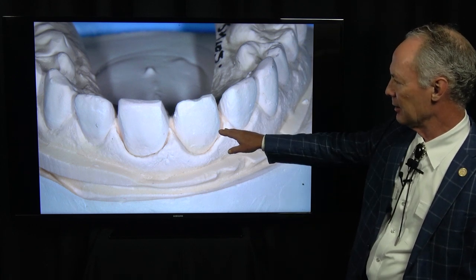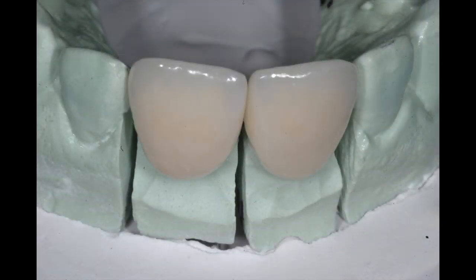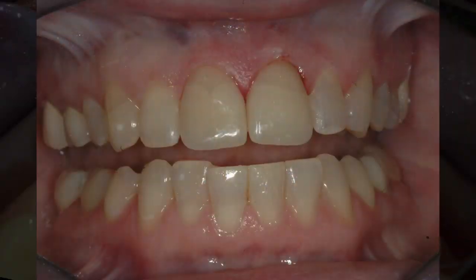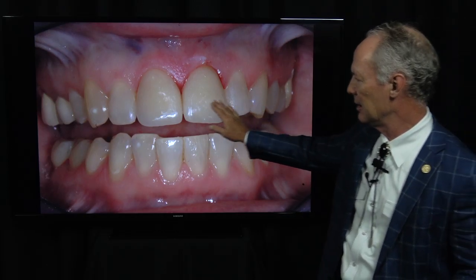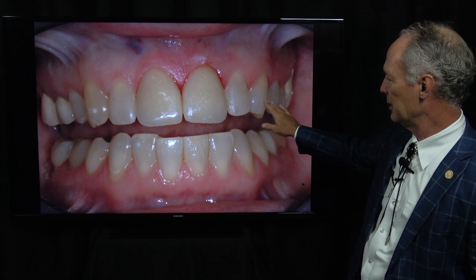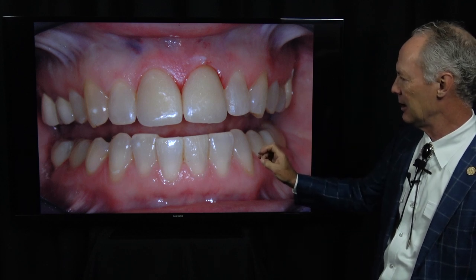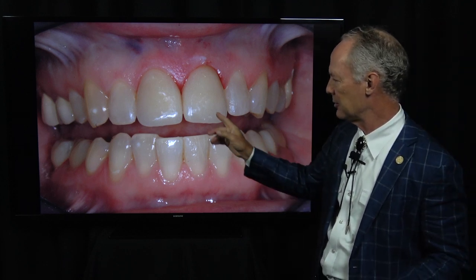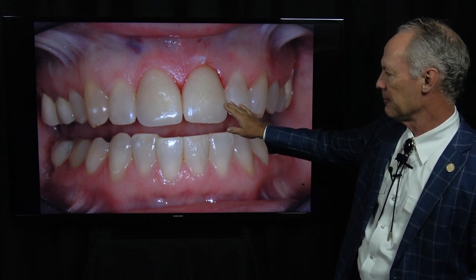This is a solid model and a die model. Now this is how you perfect the interproximal contacts of veneers or crowns. I'm trying the veneers on the teeth to be sure everything fits ideally. Looking at how the shade blends with the adjacent teeth — in this case the blend is very good, so I'm probably going to just lighten them just a hair. I'll use either a B1 or a transparent shade to barely lighten them, but that's a good mix.